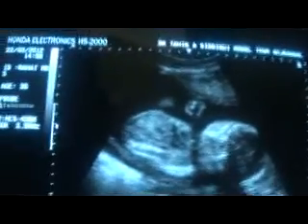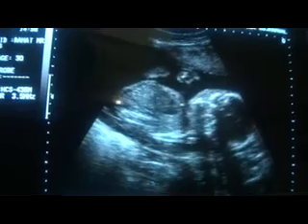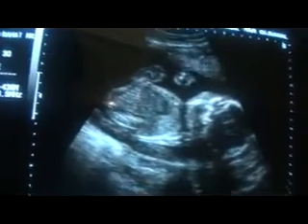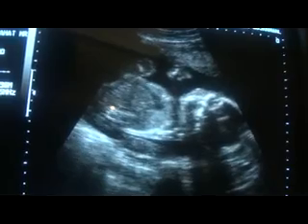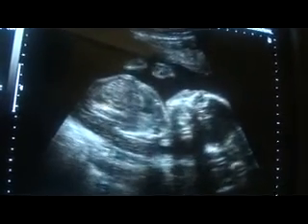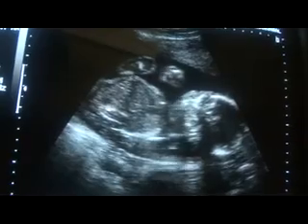This patient has been referred for the obstetric ultrasound and to rule out any adnexal or uterine pathology. So let's start with the cervix and then proceed further.